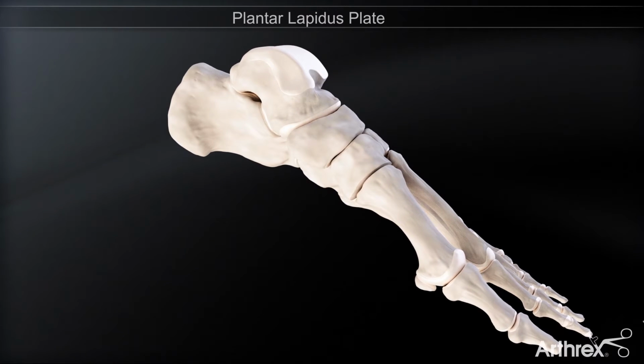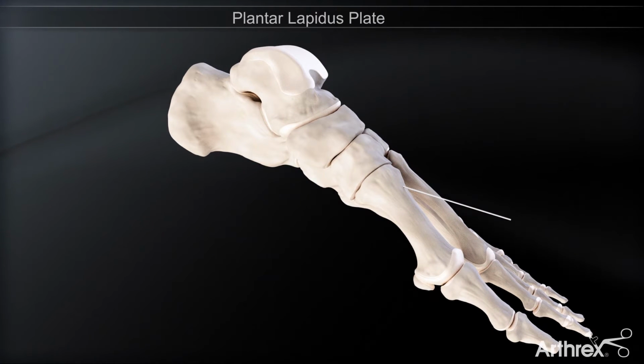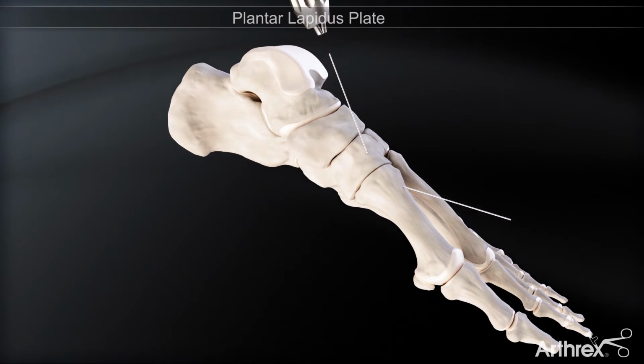Once complete, the first intermetatarsal angle is reduced and provisionally fixed with K-wires. In addition, stimublast and bone marrow aspirate can be placed into the arthrodesis site to assist in healing.